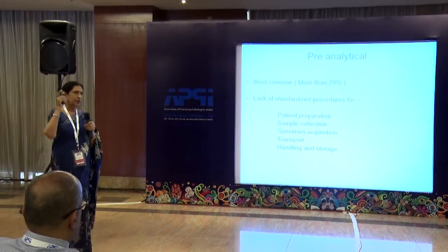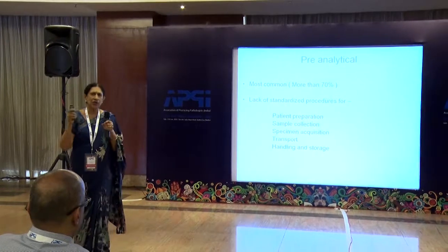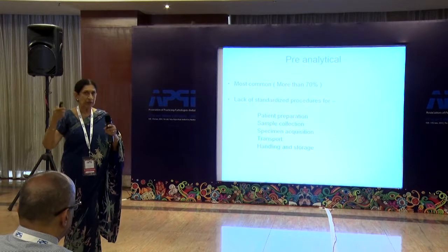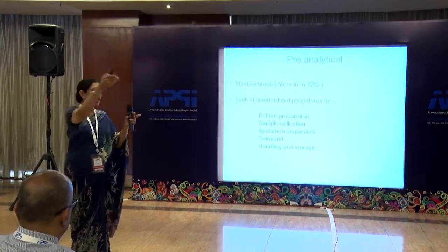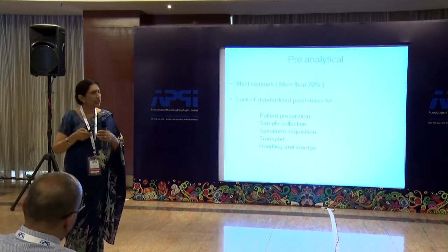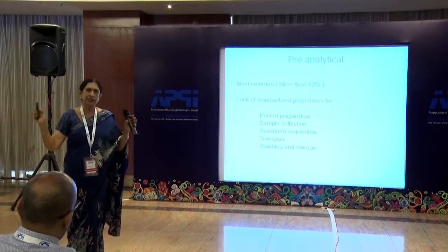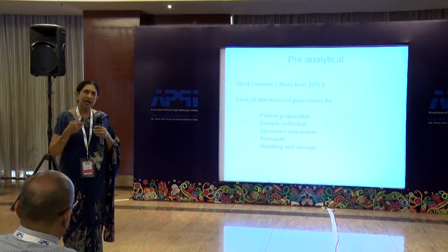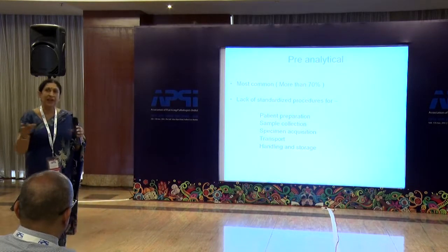Very important. That is why I don't like coagulation tests being outsourced. Sending the sample outside your city, or to another lab, it is better to say, no, I can't do this test, send that patient to that lab. Because of transportation, many of these factors are labile.